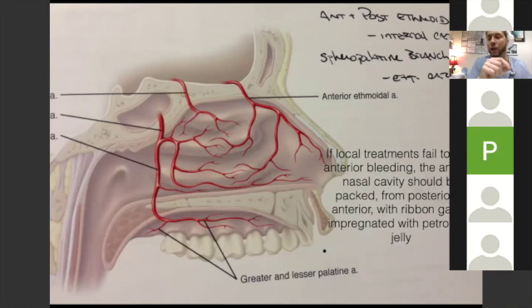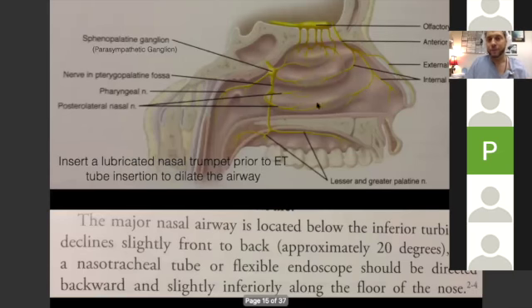And then after you've gone in with your Q-tip, take a trumpet, dip it in the lidocaine, and insert it. And that will kind of pre-dilate or open the space before you put this very rigid endotracheal tube in. So you say, oh, the 28 went in real easy, maybe then put a 30, 32. And now you know that when you go in, you're not going to do a turbinectomy and basically cause bleeding in this difficult airway that you have. Because you may choose to go orally if the nose is really tight.